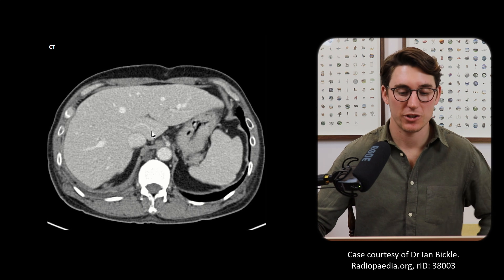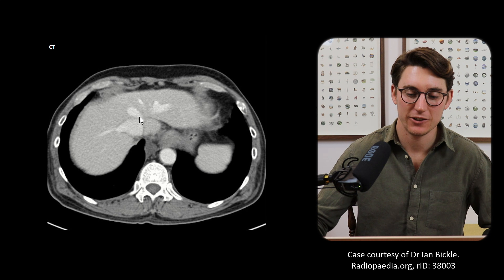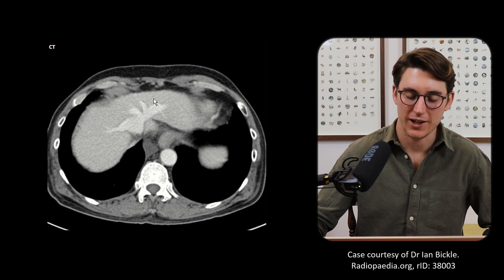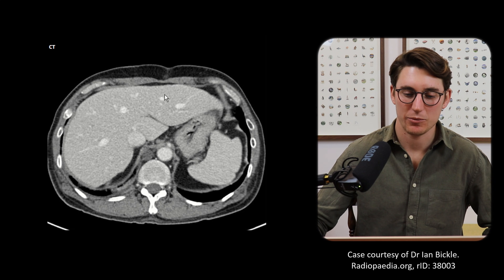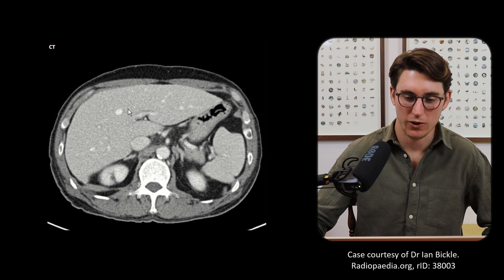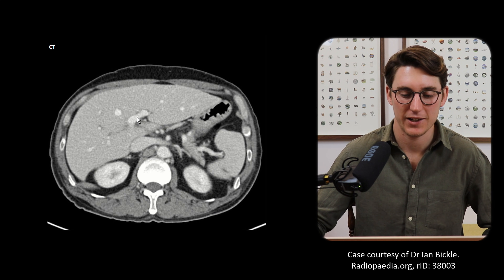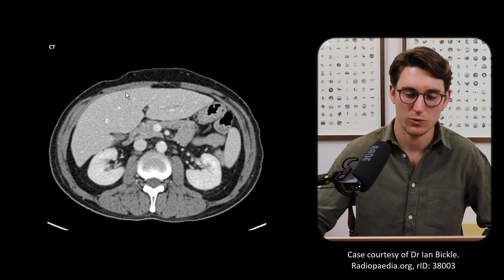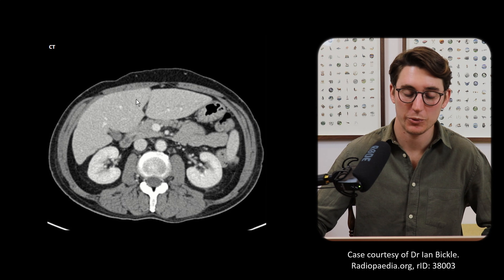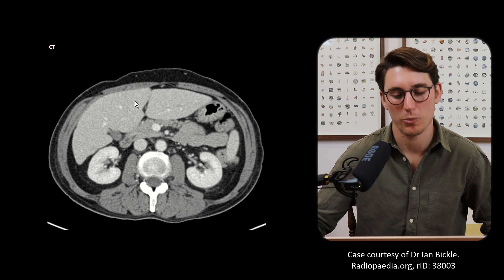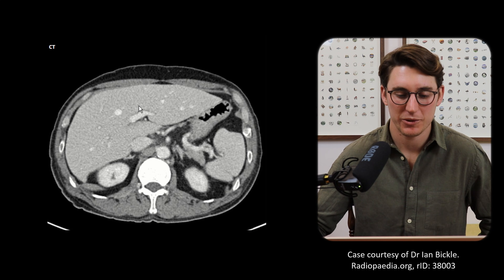Heading back up to the top of the liver, we have 4a and 4b on that left medial segment. In between our left hepatic vein and our middle hepatic vein, all of this is segment 4a — it stays 4a all the way down until we get to the level of our left portal vein. Below that is segment 4b all the way down. All of this section is segment 4b. So if we were to see a lesion here, we could confidently write in our report 'this is segment 4b' and the person reading that report will understand exactly where we're talking about.